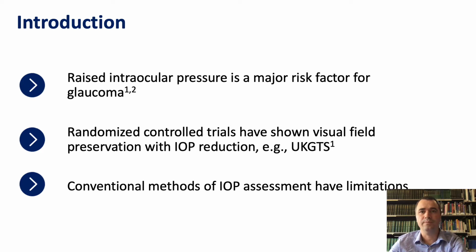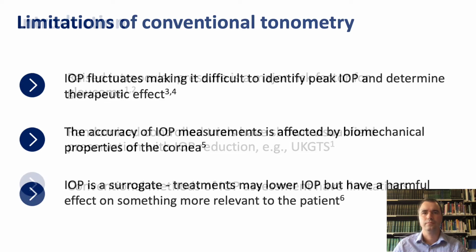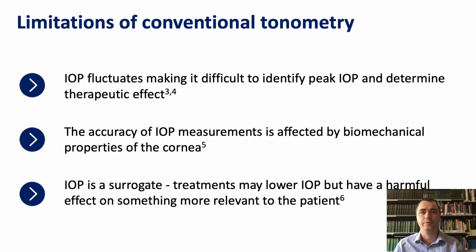Raised IOP is a major risk factor for glaucoma, with several randomized control trials showing that IOP reduction can help slow visual field loss. However, conventional methods of IOP assessment have limitations. IOP fluctuates, which may make it difficult to identify true peak IOP and therapeutic effect. IOP is affected by biomechanical properties of the cornea, and of course, it's also a surrogate for what matters most to patients: vision.